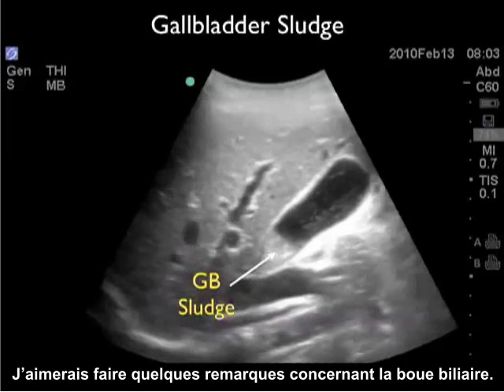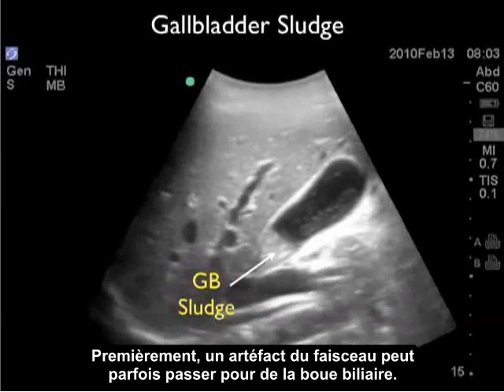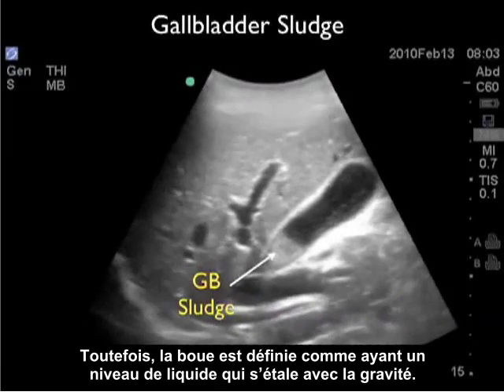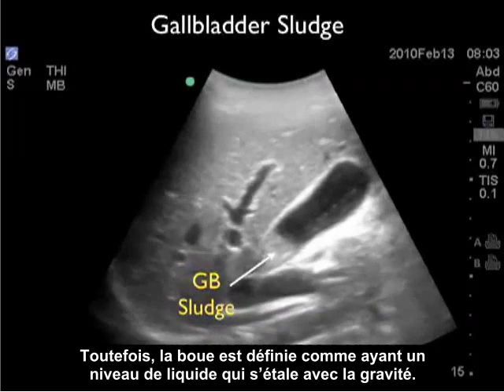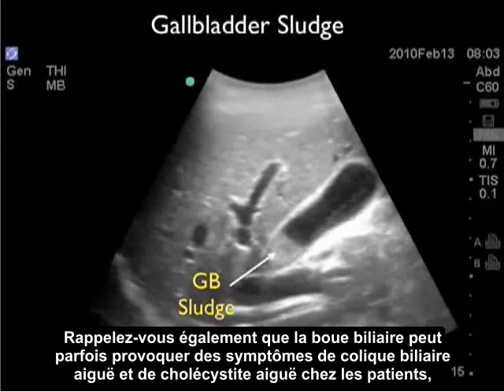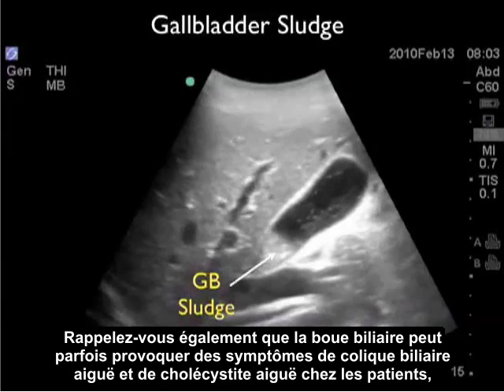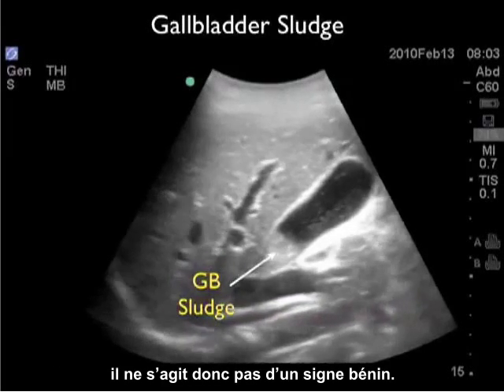A couple of key points regarding gallbladder sludge: occasionally beam artifact can masquerade as gallbladder sludge. However, sludge is defined as having a fluid level that layers out with gravity. Also remember that gallbladder sludge can occasionally cause symptoms of acute biliary colic and acute cholecystitis in patients, so it is not a benign finding.